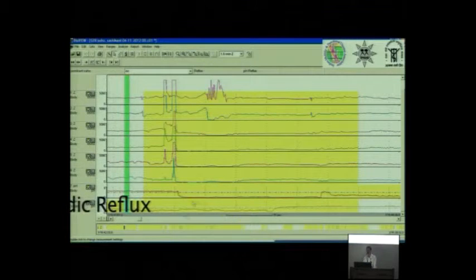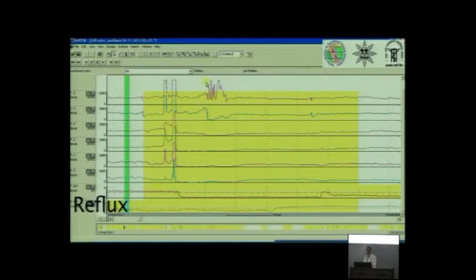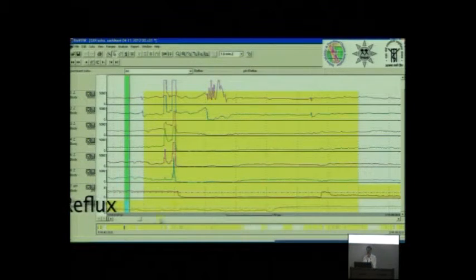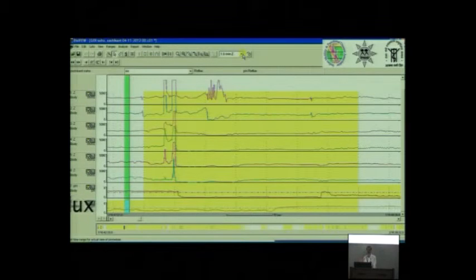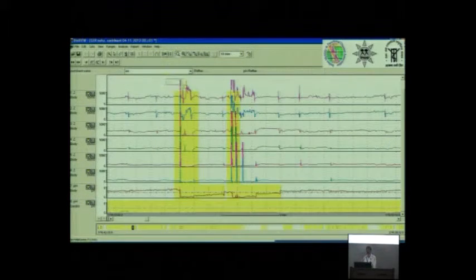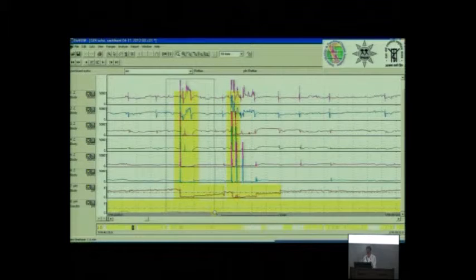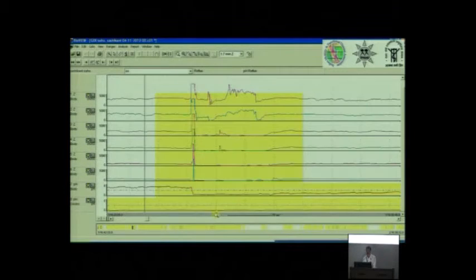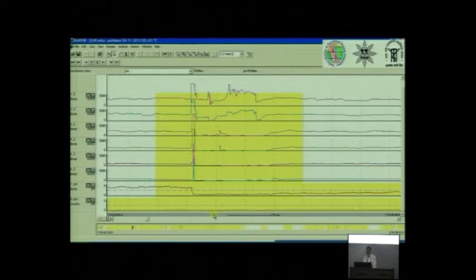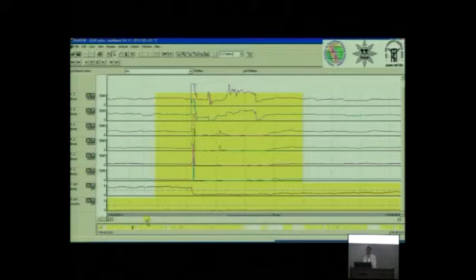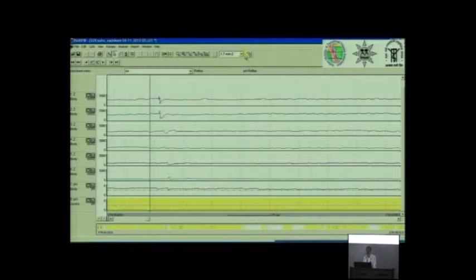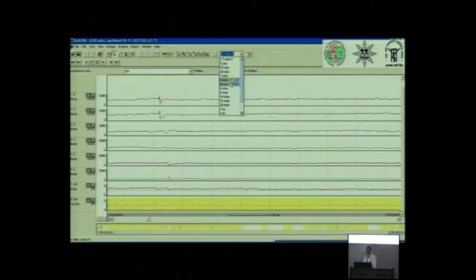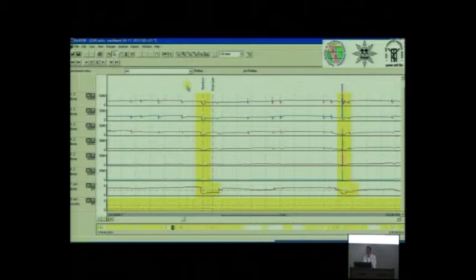You can make out whether it is an acidic liquid or is it non-acid liquid. Typically this is not an alkaline recorder, so you don't say alkali reflux, you say non-acid reflux. It may be neutral, it can be alkaline. So you scan the whole record of 24 hours like this.